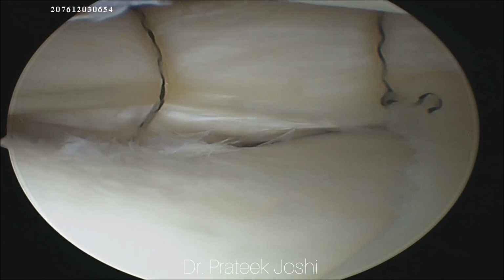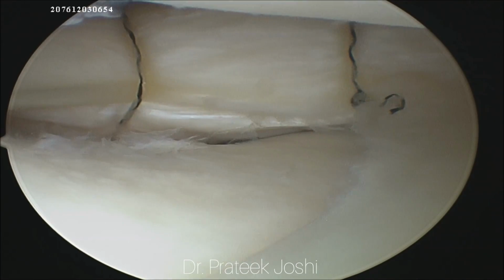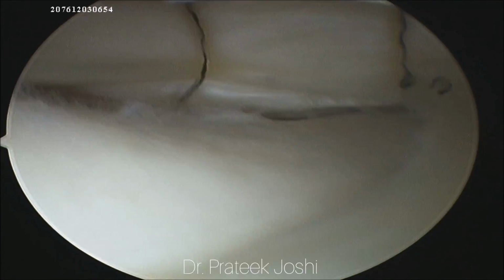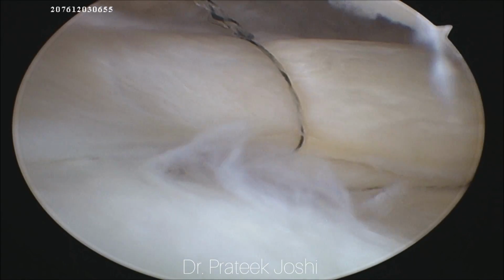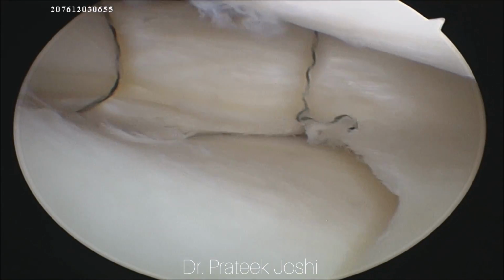So this is the final picture of the lateral meniscus repair. You can see the repair is quite strong and it is quite stable, and we hope that this is going to heal quite well.